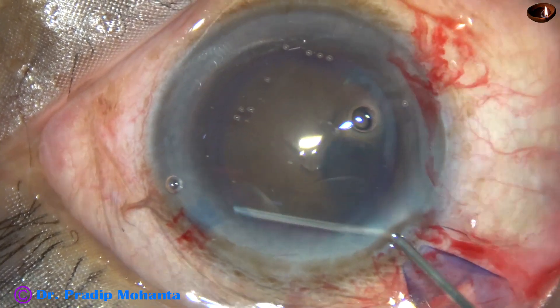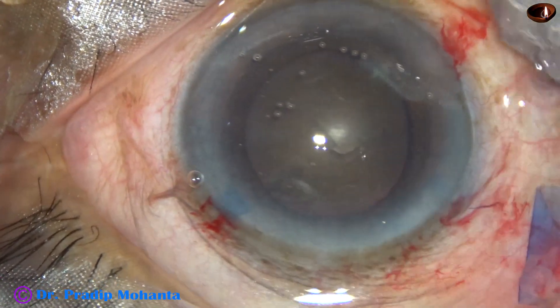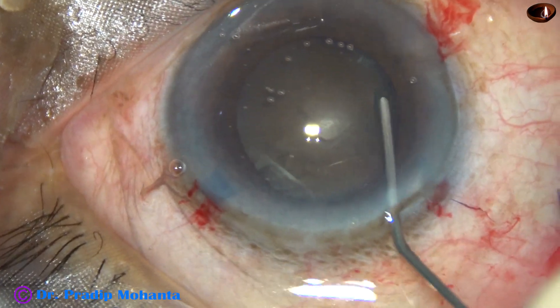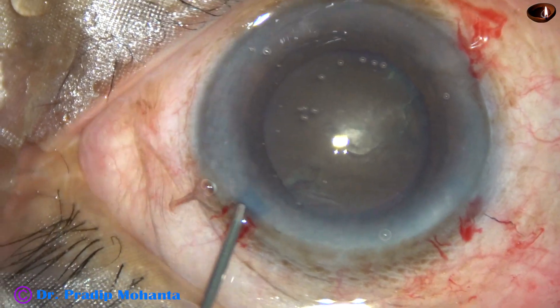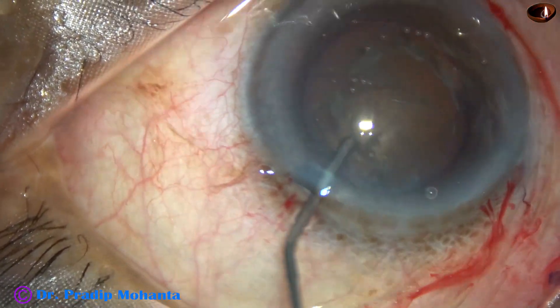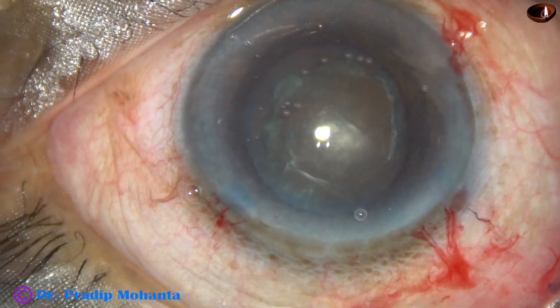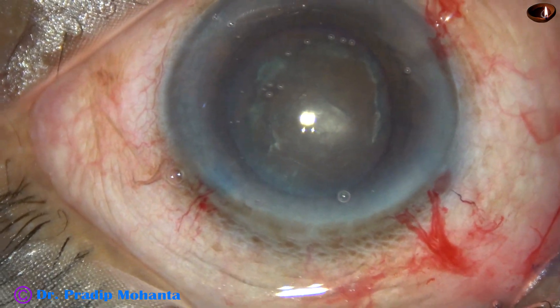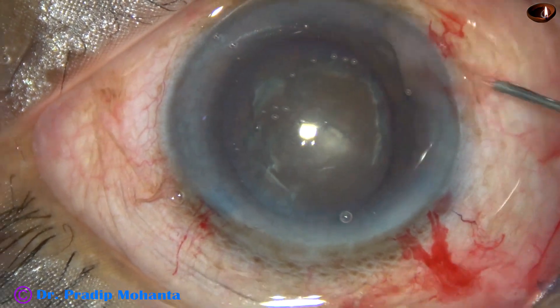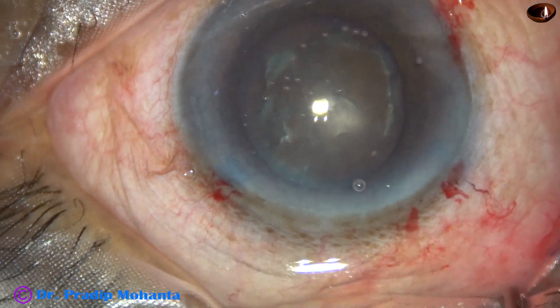Hydrodissection is done at multiple points. The nucleus is tapped. Hydro is again done, and now the nucleus is mobilised — you can see that the nucleus rotates very nicely. Now visco is again injected and the anterior chamber is filled up with visco. This is adrenalin to see if the pupil dilates a little more.